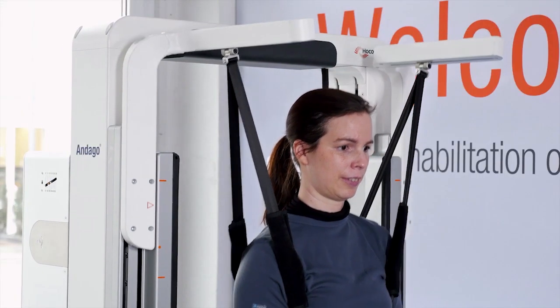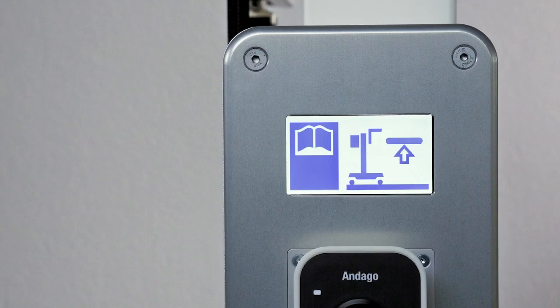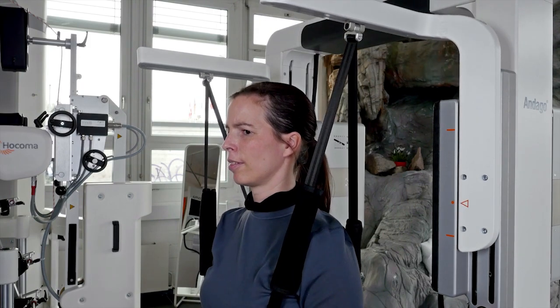When your patient reaches the mechanical limits as indicated by the orange lines, Andago will display an error message. Use these lines as a reference to see how much displacement you are providing to your patient.